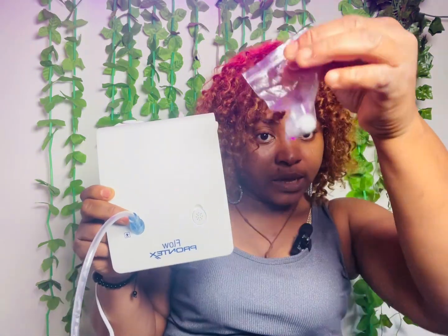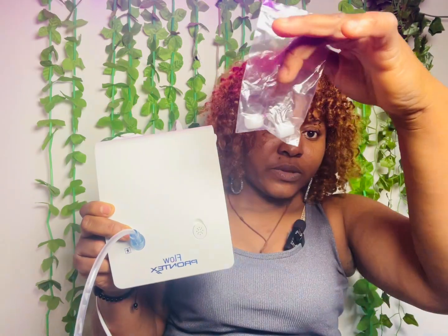When the air filter inside is dirty, or you feel there's a need to change, you take from this one, which is the spare, remove the old one, change it, and then cover it back. This is where you're supposed to change the air filter. They kept 2 here as reserve. It means there's one in there already that might be dirty or clogged up, and then you change.